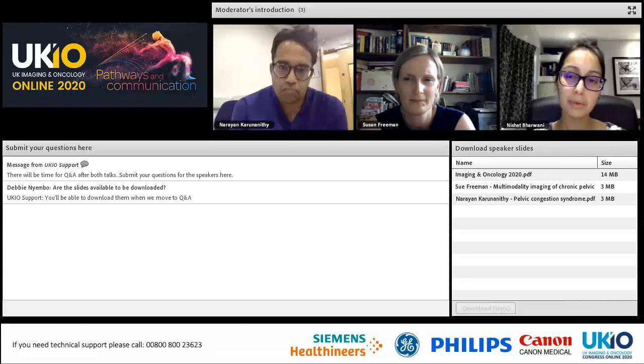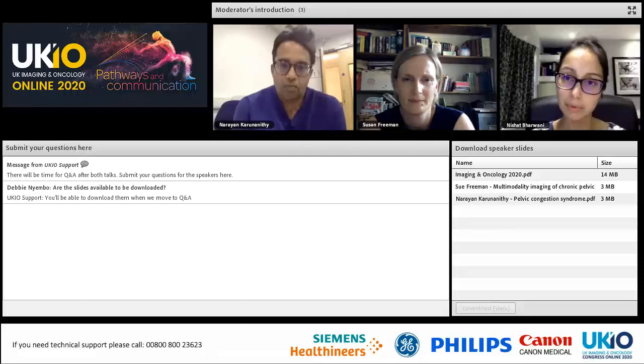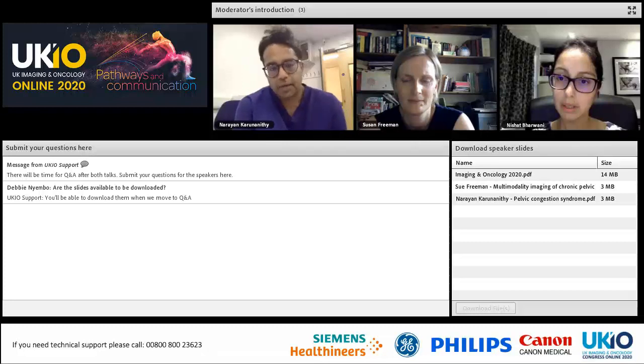What is it that a sonographer might put in their report to help with the diagnosis of PCS? Are there specific things that you would want them to look for? Any dilated ovarian or uterine veins greater than 6 millimeters in diameter, demonstrating either retrograde flow or retrograde flow on Valsalva, would be worth commenting on, in my opinion.